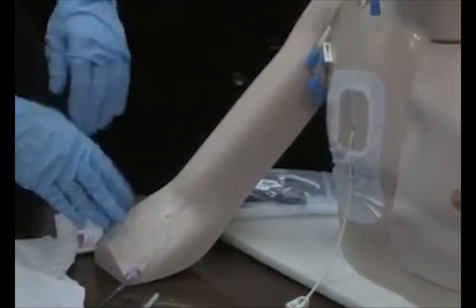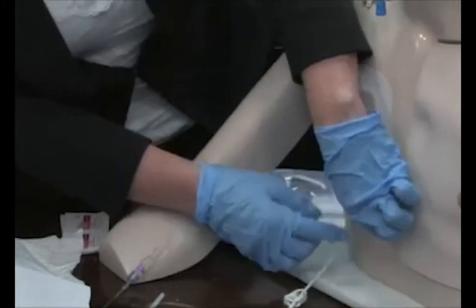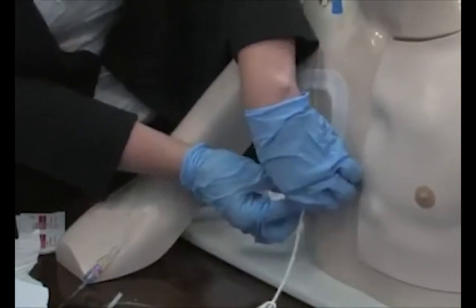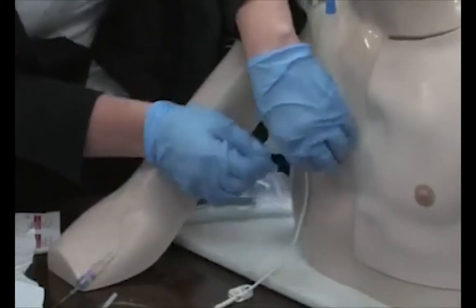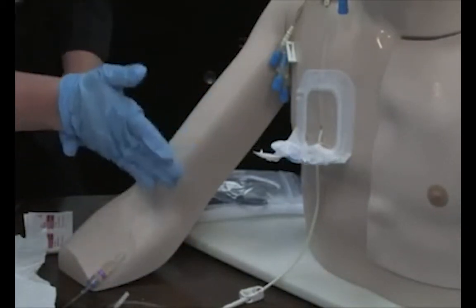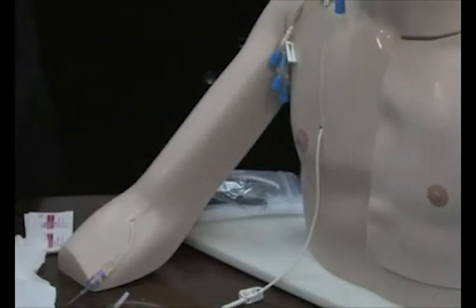And when you go to remove it, and we have a video available to you from the manufacturer that is just a great view of all of this, you literally look for these little notches and you tear the notches like such. And you want to roll the Sorbaview up. Okay, so if you were doing a PICC line, you want to tear the little notch and roll it up toward the patient. You never want to remove a PICC line dressing this way for fear of dislodging the PICC or pulling it out at all. So this literally just rolls up, and that's how you remove it.